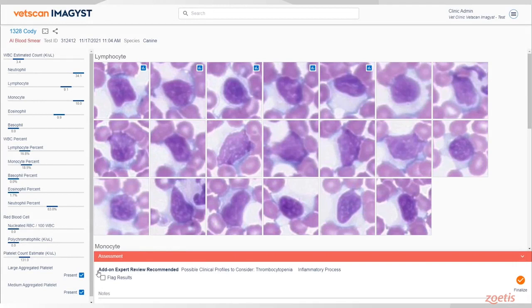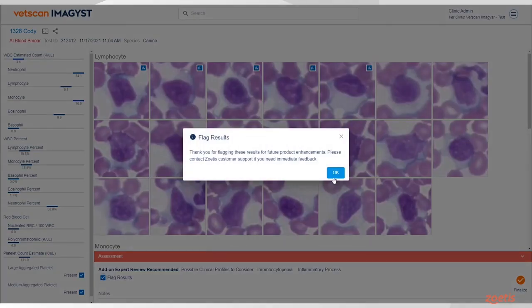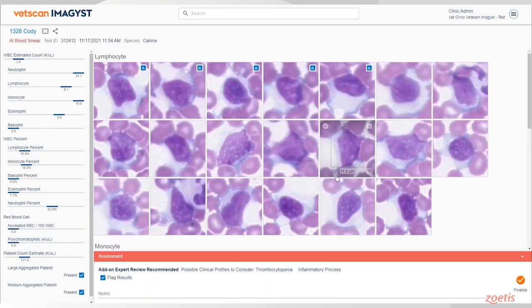There is an opportunity to review the slide yourself. When you scroll to the bottom, you have the option to flag the result. A flagged result alerts us to look at the image for future algorithm training.